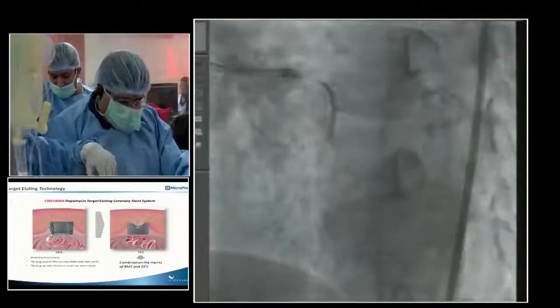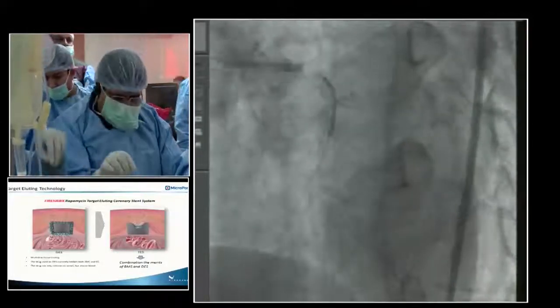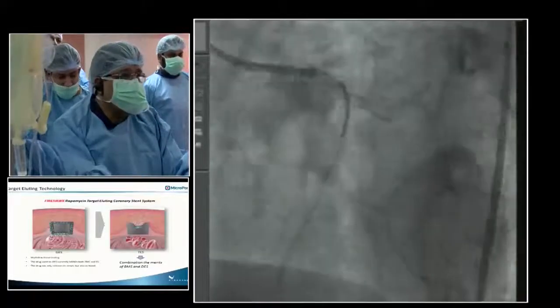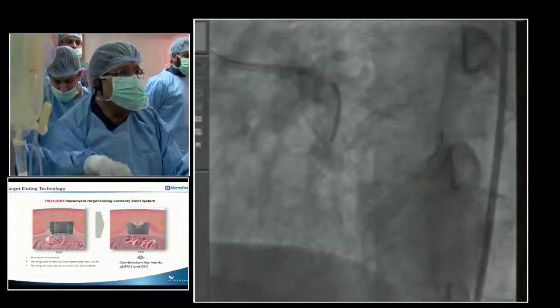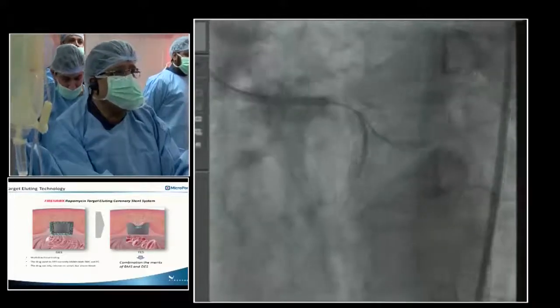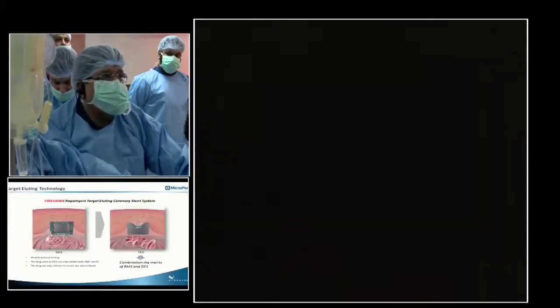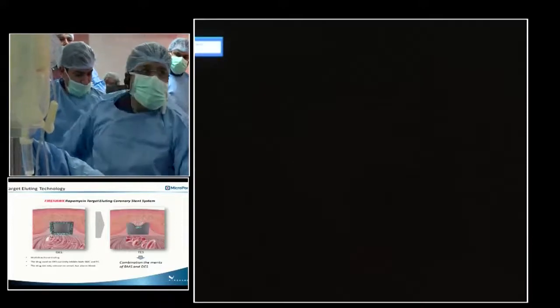There is not too much sucking in of the guide. Small test. Which is a circumflex wire. This is the circumflex. So now I'm pulling the wire and seeing till this place. Okay, shoot. We can pull it. The outlet of the stent looks okay. There is no obvious dissection.